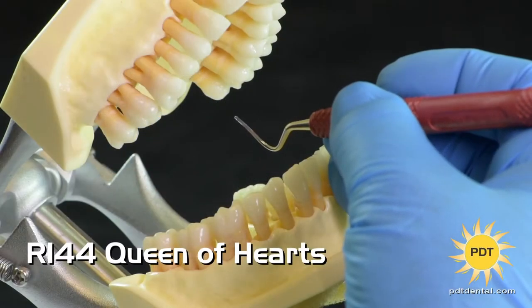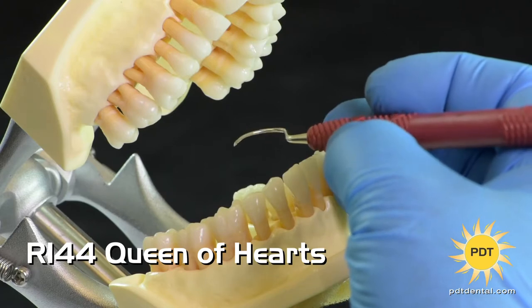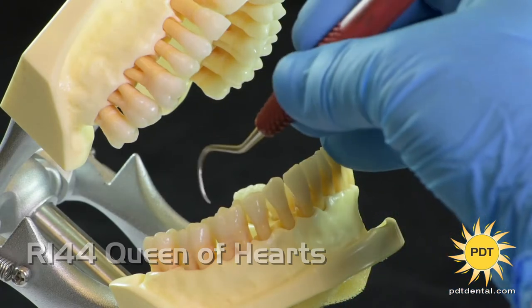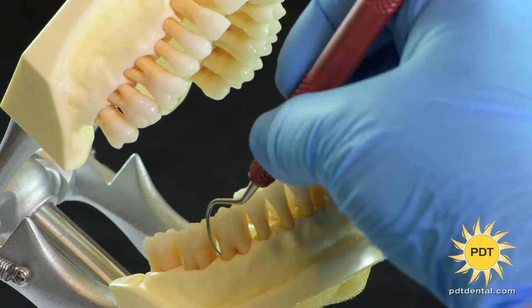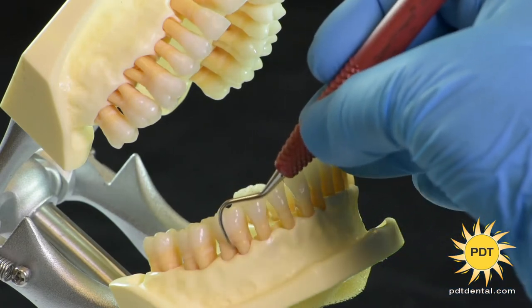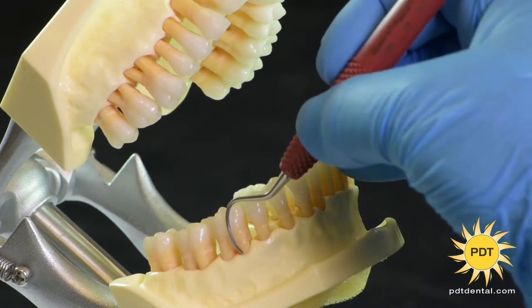Hi, I'm Wendy Bertels, RDH, and this is PDT's Queen of Hearts. The Queen of Hearts is a unique periodontal curette, which allows better access for line angles and blade adaptation in deep pockets where furcations and irregular root surfaces are found.